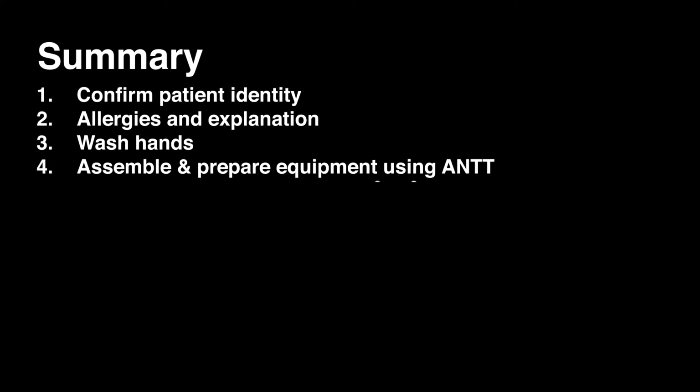In summary, confirm your patient's identity. Ensure the patient has no known allergies and the procedure has been fully explained. Wash your hands and then assemble and prepare all drugs and equipment, ensuring an aseptic non-touch technique is maintained.